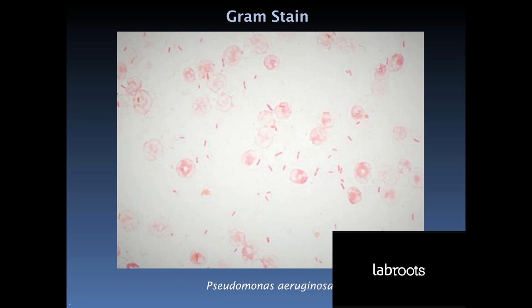On my very best day at the bench, it would have been a stretch for me to have made the Pseudomonas call on this one. But we do have some superb microbiologists in this country who can make calls like this. To me, it is a scandal that contributions like interpreting this sort of gram stain as Pseudomonas are not recognised when it's time for annual evaluations and pay raises. And incidentally, I'm confident that my wife Gina could look at this slide from 20 yards away and say, that's Pseudomonas.